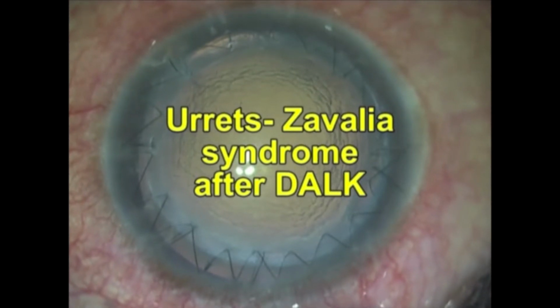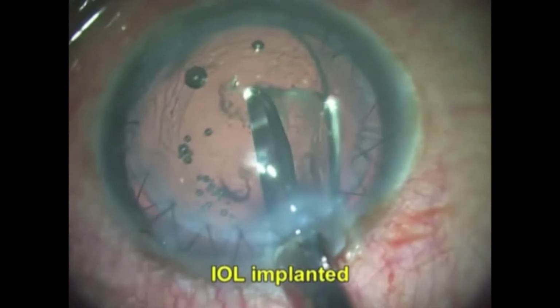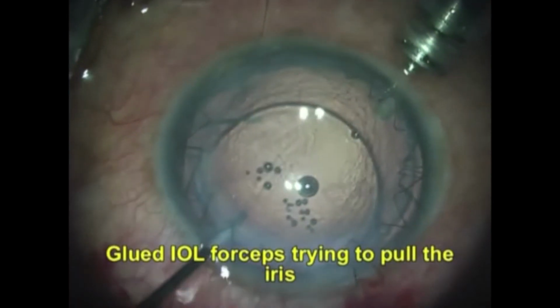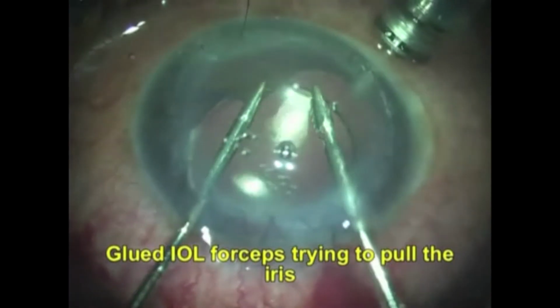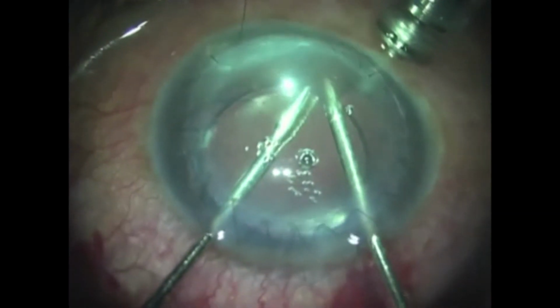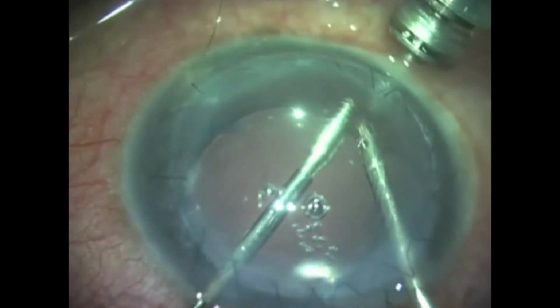Urrets-Zavalia syndrome can occur after DALK, and if the eye is phakic one can make it pseudophakic and then perform the single-pass 4-throw pupilloplasty.